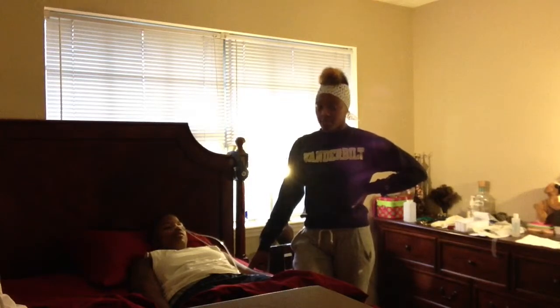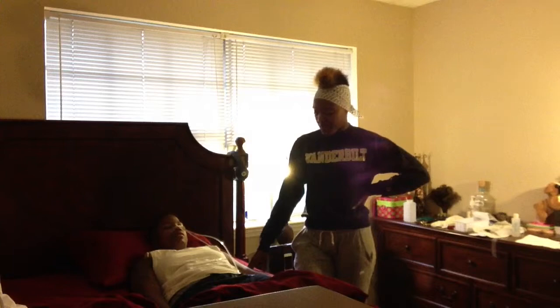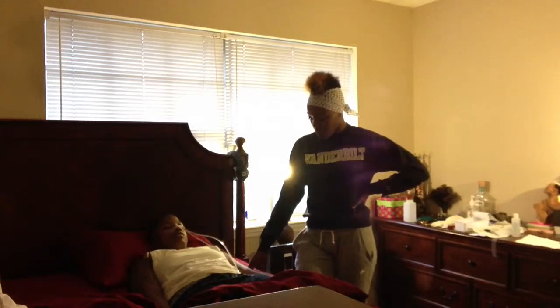When I document, I want to document the size and the type of tube that I inserted. I want to document the time and the date of the procedure, and how well Ruby tolerated the procedure. While in the room, I would have checked her respiratory rate, depth, and rhythm, and so I would document that. I would document if there were any issues with inserting the tube, and that is all. Oh, I would have washed my hands before leaving the room.